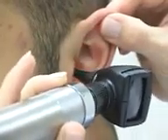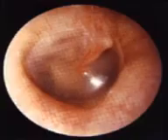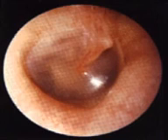So you'll look behind the ear, look at the pinna, lift up and back on the pinna to straighten the external canal, brace with your little finger, place your speculum gently inside the tragus, move forward until you see your landmarks. And you're done. You should give your patient permission to tell you whether this is uncomfortable. If you are hurting the patient, you are doing something wrong because you shouldn't be. That completes the ear exam.